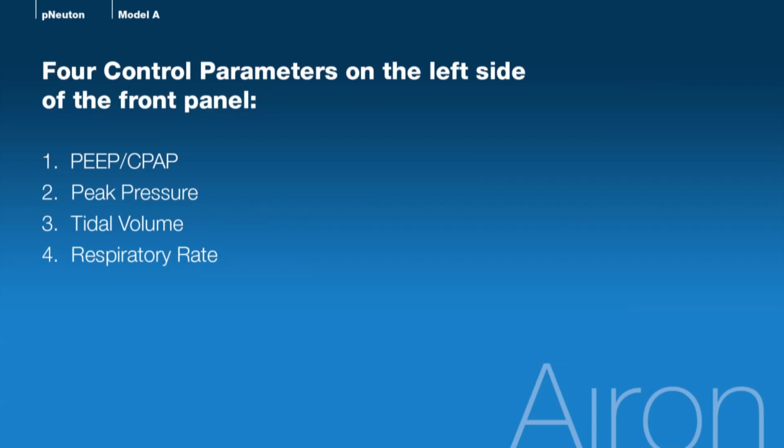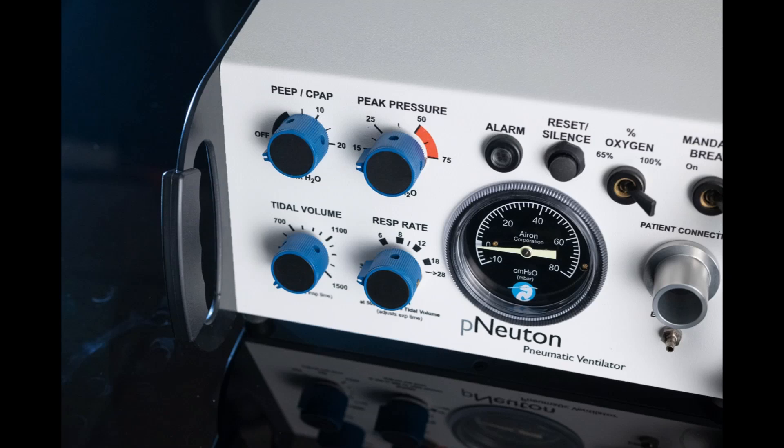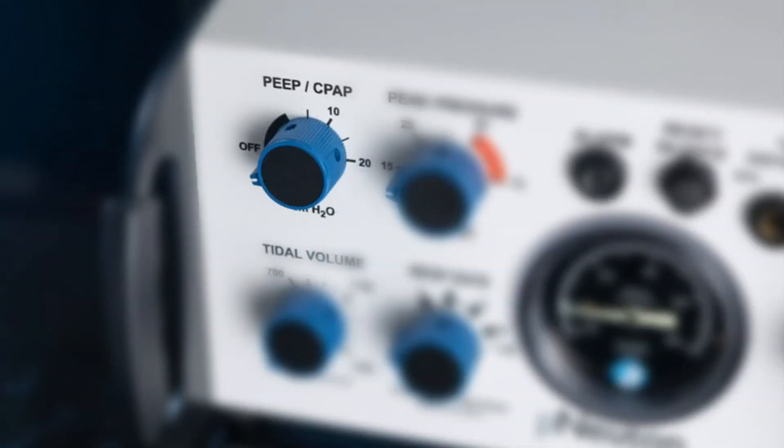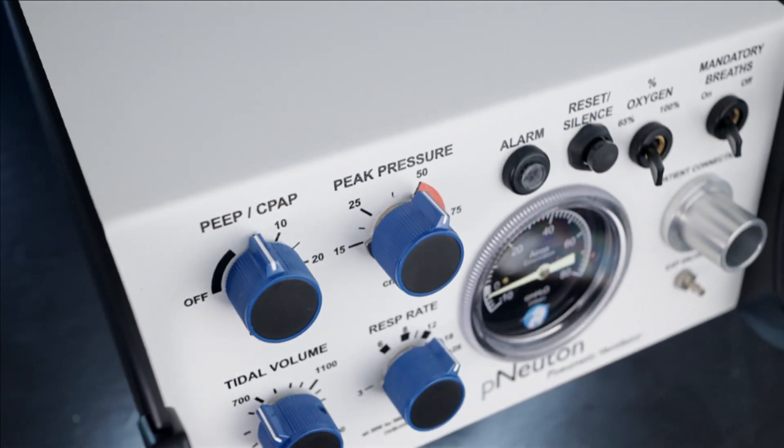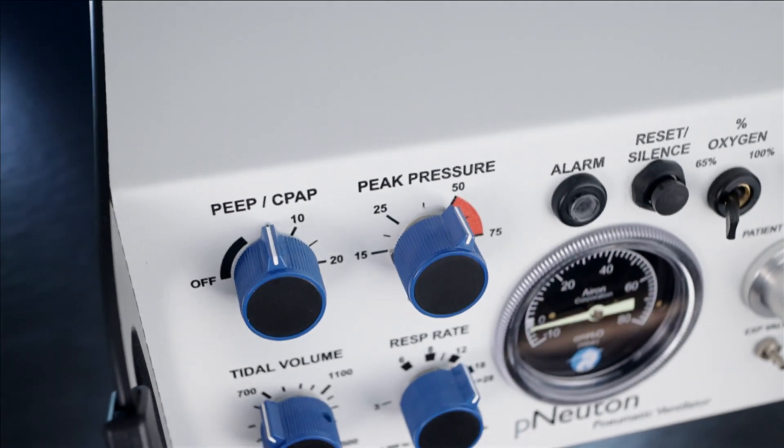PEEP/CPAP Control. Let's start at the top left with the control that provides both PEEP and CPAP. When the device is set for ventilation mode, PEEP will provide the baseline pressure. When not in ventilation mode, it supports CPAP for spontaneous breathing. The PEEP/CPAP Control adjusts up to 20 centimeters of water and has automatic sensitivity for changing patient needs with a maximum flow rate of up to 140 liters per minute. The patient receives the FiO2 set by the percent oxygen control. The PEEP/CPAP system is very responsive with low work of breathing, similar to critical care ventilators within the ICU.